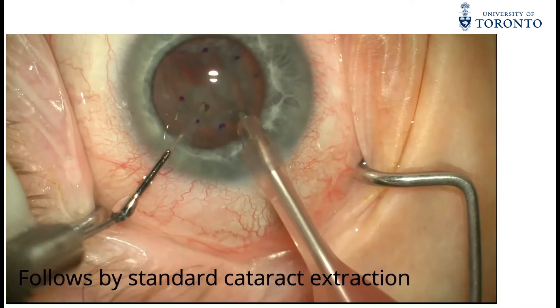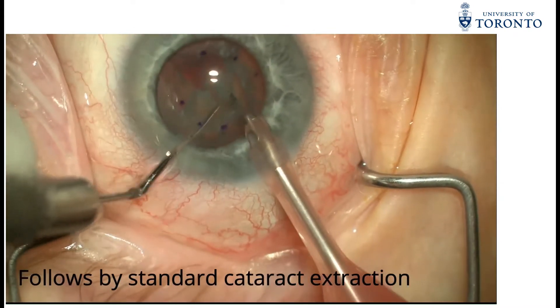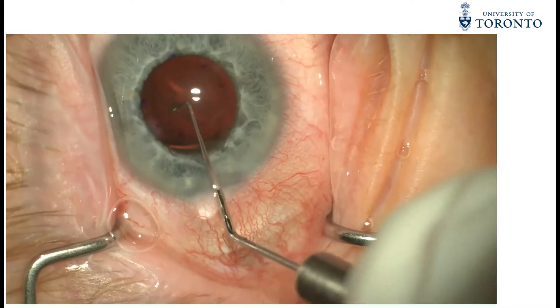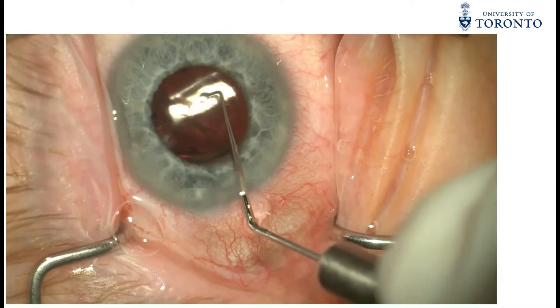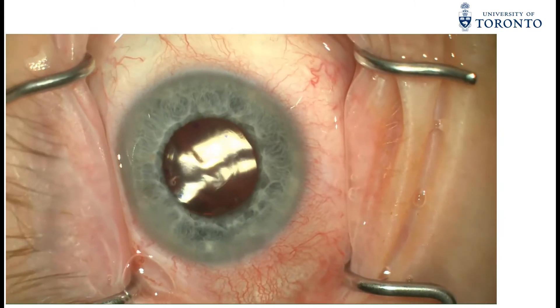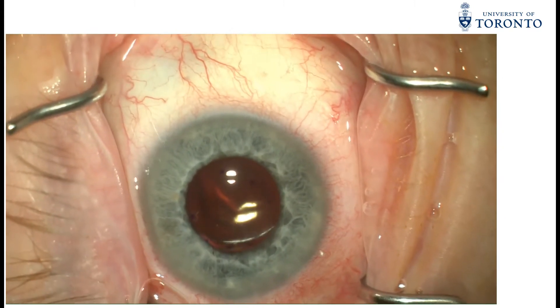A standard phacoemulsification technique is then performed with a 5.5mm continuous curvilinear capsulorhexis and in-the-bag IOL placement. Cohesive viscoelastic is left in the anterior chamber to maintain stability for performing the descemetorhexis.